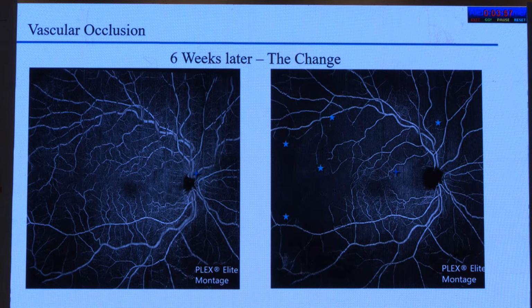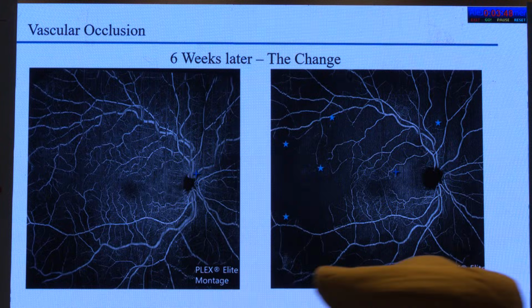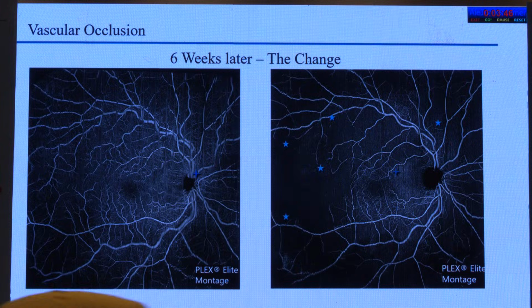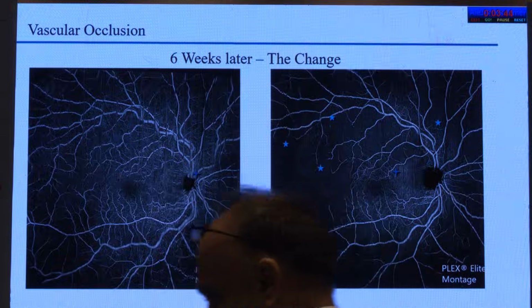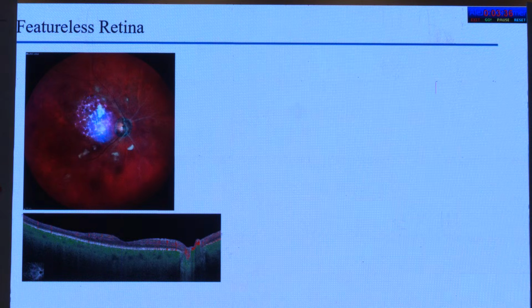Vascular occlusion, again, is something where you can see CNP areas and study the FAZ on OCTA. But what is very defining about OCTA is the change from non-ischemic to ischemic, which can never be picked up on fluorescein angiography because of the hemorrhages. And OCTA really delineates it very well as we shift from non-ischemic to ischemic CRVO.